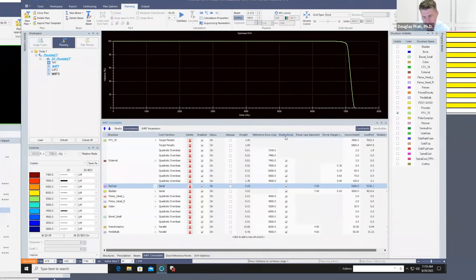If it turns off, okay. And if you can switch it to Pareto, and if you hit the double arrows here, it says down here it'll continue stage one. But if you hit the double arrows, it actually will immediately jump to stage two. You ran stage one, and stage one we ran constrained. Now stage two we're going to run Pareto.